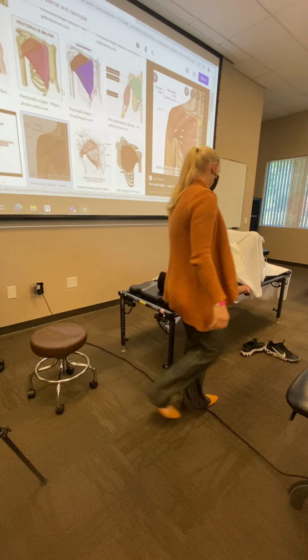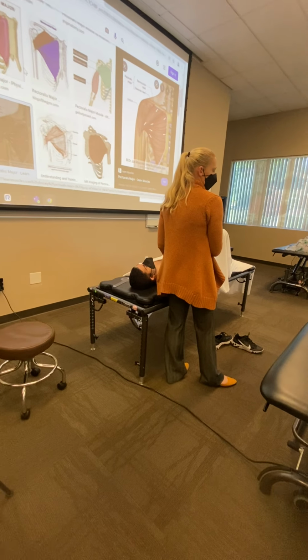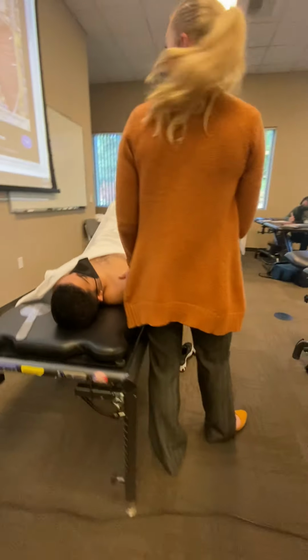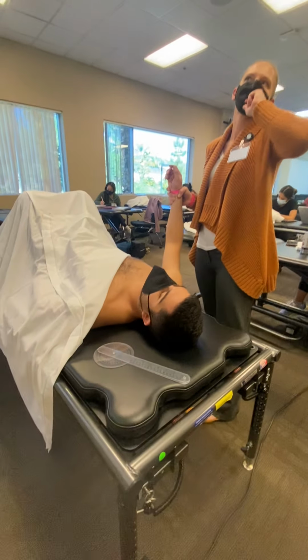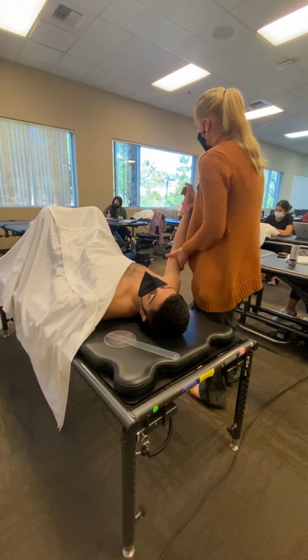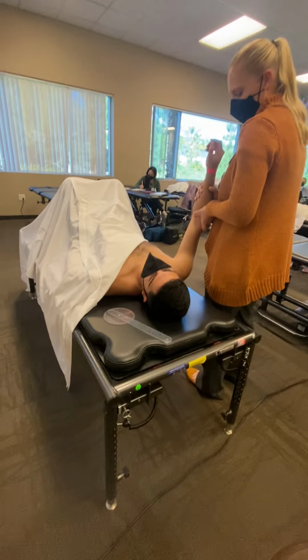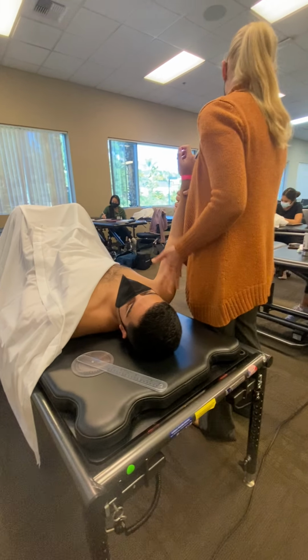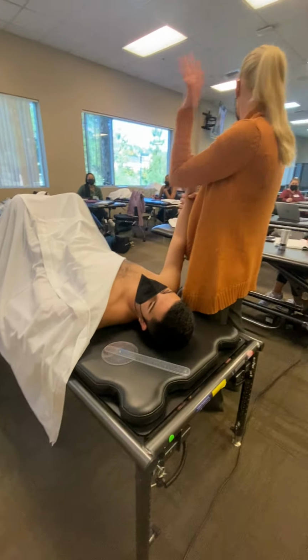So for clavicular fibers, you're going to have the shoulder abducted to 90. Oh, can you? Yep. Sorry. There we go. Thank you. So externally rotated, shoulder abducted to 90 degrees. Again, please use your high-low tables. This table is making me so mad, but I would have the table up higher so that you can save your back.